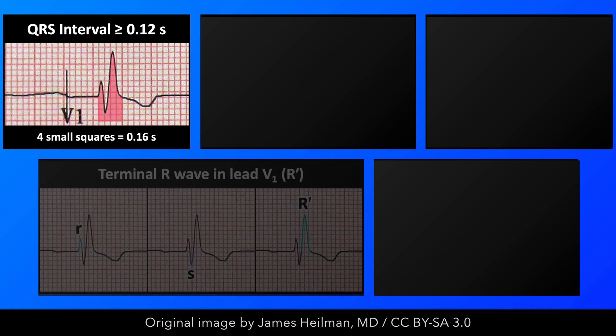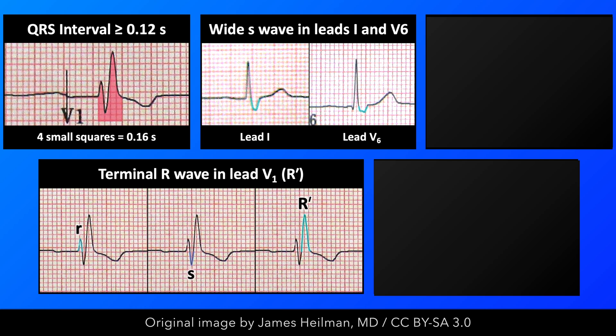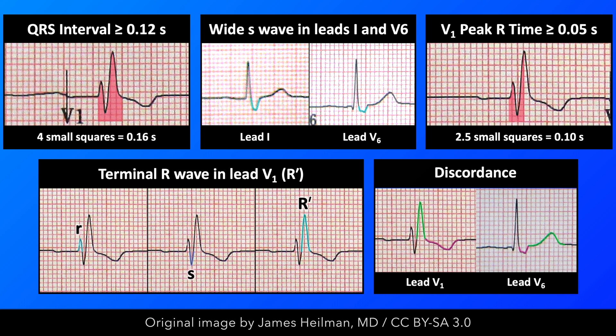To quickly recap, the ECG features associated with a right bundle branch block include QRS prolongation, a large terminal R-wave in right-sided leads, a broad or slurred S-wave in left-sided leads, a prolonged peak R-time in V1, and discordance of the ST-segment and T-wave.